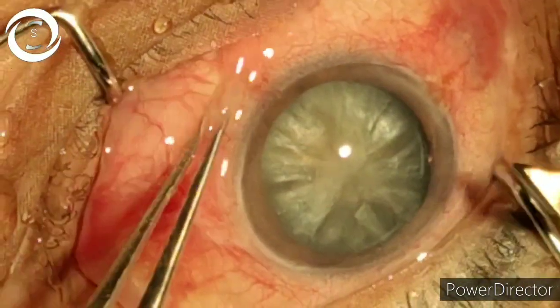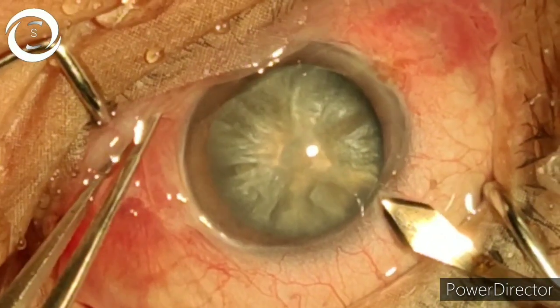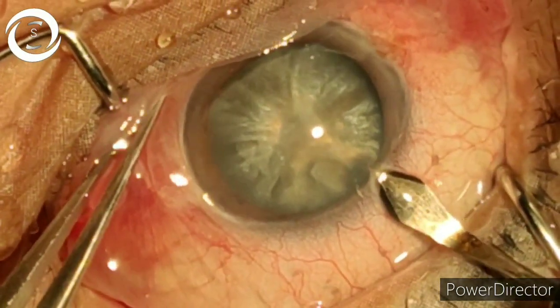I am Dr. Sharjeel and today I would like to show you how to perform phacoemulsification in a very hard, mature cataracta nigra case.